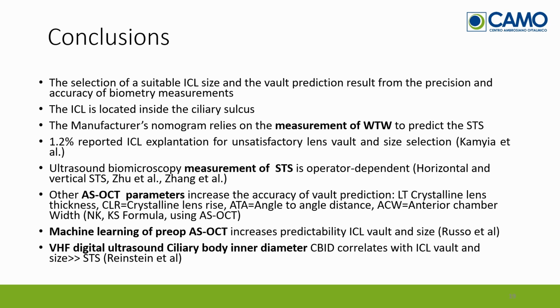So in conclusion, we know that the prediction of vault and the selection of ICL size remains a critical factor in determining the success of the surgery. And we know that access to multiple diagnostic devices increases the accuracy of surgical planning.